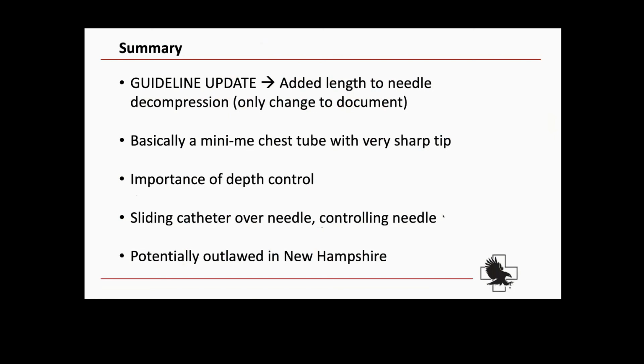Just as an FYI, there are some anecdotal reports from New Hampshire from non-critical care transport crews and EMS agencies that have had some injuries to lung tissue or other structures using this device. So that's why we really want to be cognizant of this. It's a great device. It has increased diameter. It has functionalities that don't come with our IV catheters. I think we'll find great success with it, but we definitely need to train up to utilize it in a safe manner. And that's all I got for guideline updates for needle decompression.